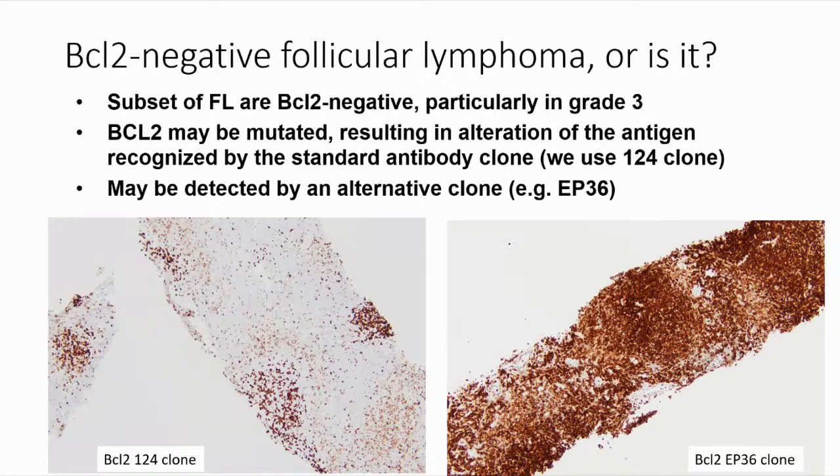When you do a core biopsy, you sometimes see just a diffuse-only proliferation. You don't know if it's the diffuse variant or if it's a mixed follicular and diffuse pattern. Pretty much anything can happen in follicular lymphoma, because it's so common and it can show a wide range of morphologic features.